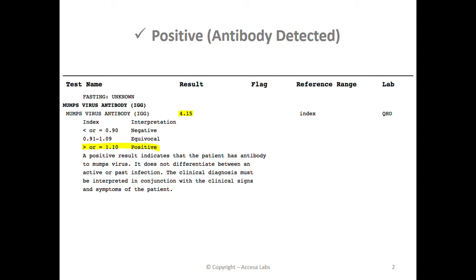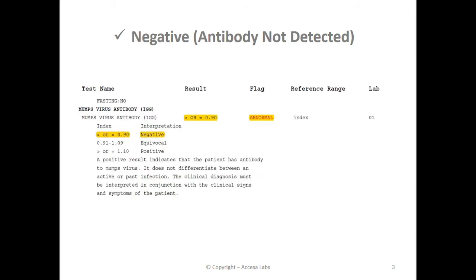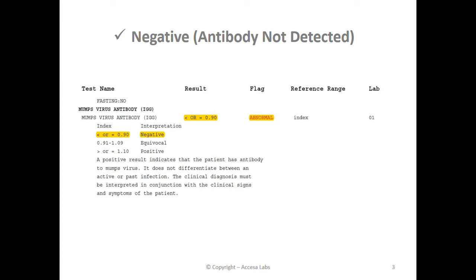Now let's take a look at a negative result. We'll look under the result header — less than or equal to 0.90, with a flag of abnormal. Based on Quest Diagnostics Result Index shown here, any result less than or equal to 0.90 is negative, which implies that a person with this result does not have immunity to the mumps virus. Therefore, this sample report represents a negative result.